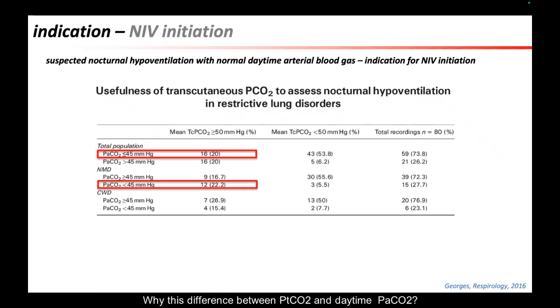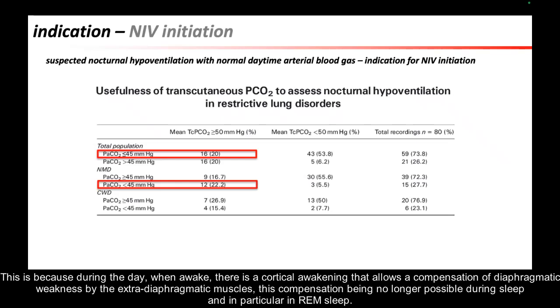Why this difference between PtCO2 and diurnal PaCO2? This is because during the day, when awake, there is a cortical awakening that allows a compensation of diaphragmatic weakness by the extradiaphragmatic muscles, this compensation being no longer possible during sleep, and in particular in REM sleep.